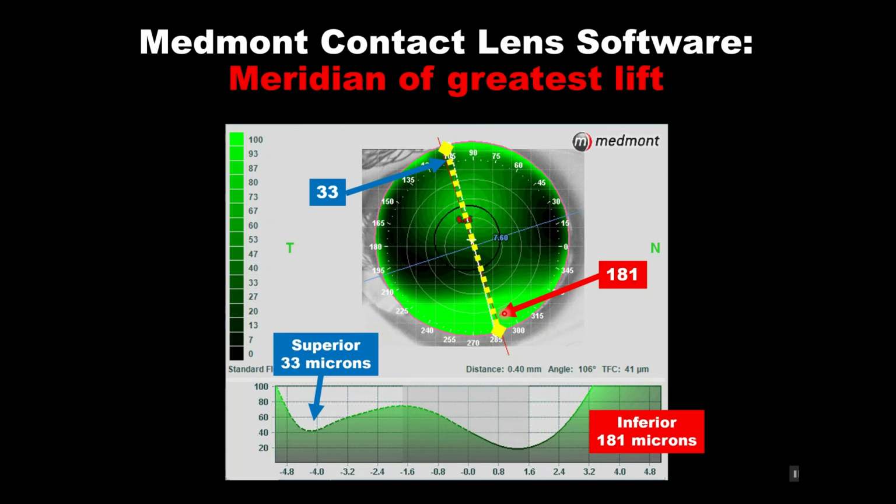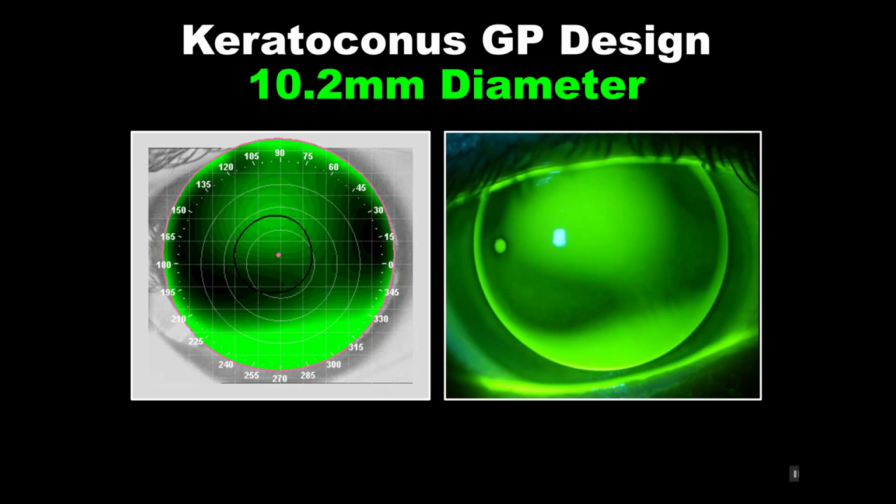Bubbles are created at around 90 microns, so it may be possible that a bubble can get in there. Now, this patient had 334 microns of differential, so the elevation map was suggesting that corneal GP should work. When we use the contact lens software, we liked the horizontal relationship. We were concerned about the vertical, but since at least half of the contact lens looked good, we thought, let's give it a try. And here's the actual outcome.